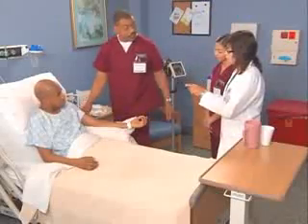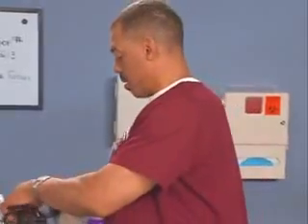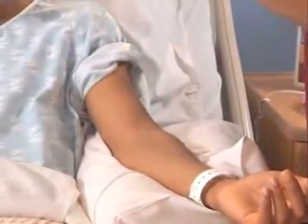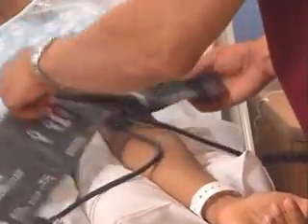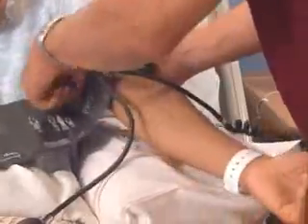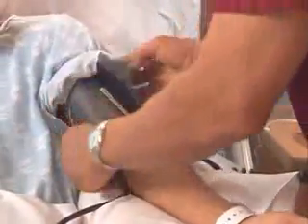And now, Steve, would you place the cuff on Mr. Betts? Sure. And where does the artery marker on the cuff go? Right in line with the artery in Mr. Betts' arm. And I'm going to wrap the cuff so that it's nice and snug.